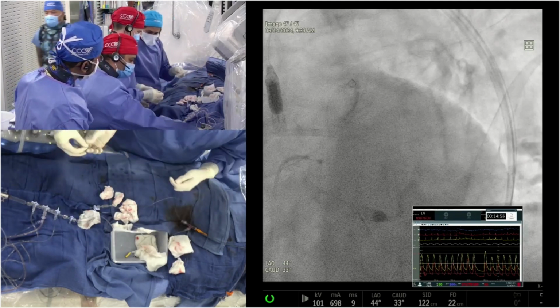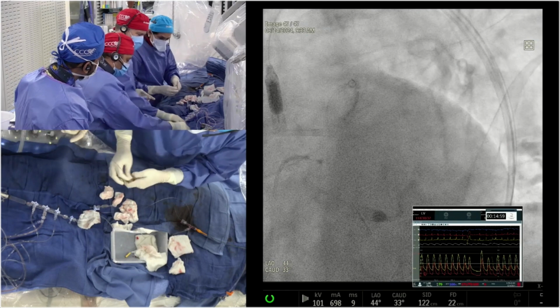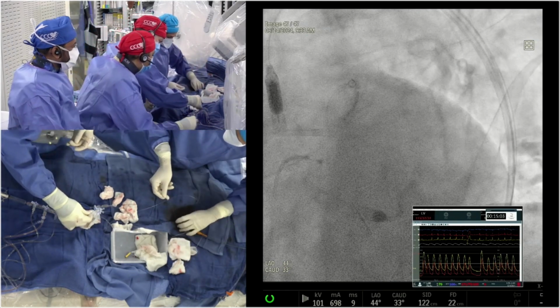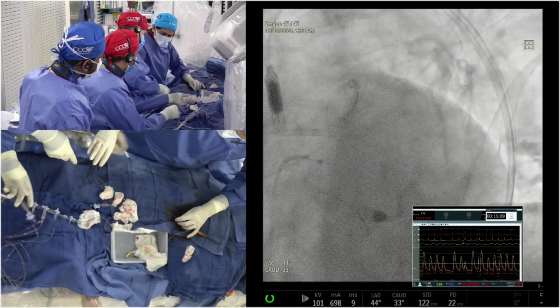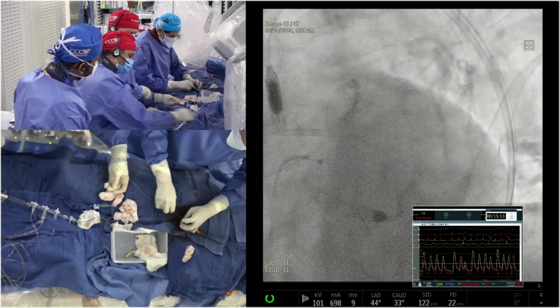I mean, you see how much work there is. Darren McGuire and Bob Harrington are here. Darren, how many papers have you published in Circulation? Dr. McGuire is our deputy editor of Circulation. Sixteen papers on hemodialysis patients, right? Correct. What do you think about what's going on here?